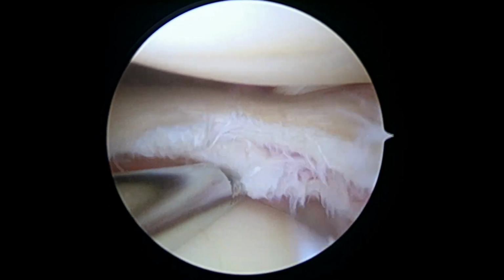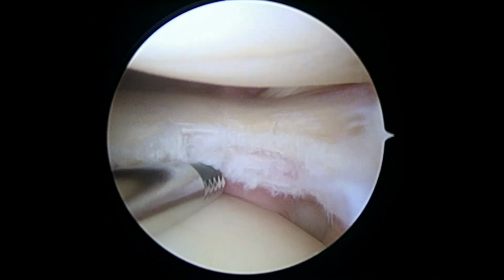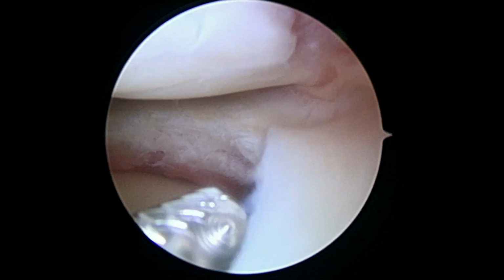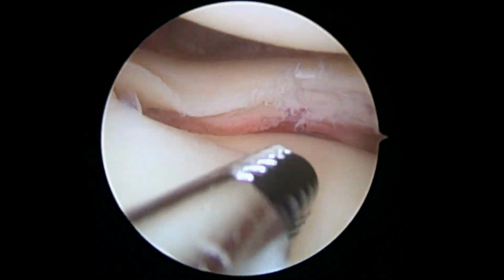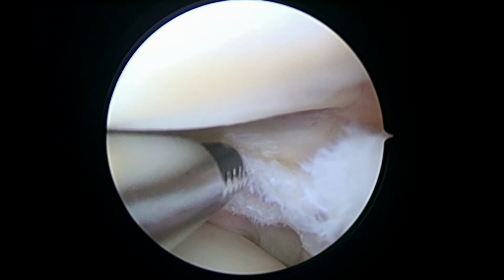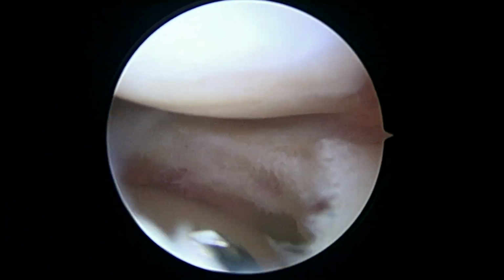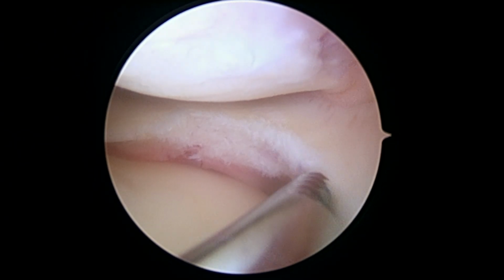So some of this is already kind of taking care of itself, as you see here. In fact, I don't know that we can do anything else to the meniscus at this point. Posterior horn back here looks pretty good, so that's the main part we were worried about. This is already torn and there's really nothing left to repair there. And then here anteriorly, same story. And so now we have a pretty good look. So I don't think we have to do a meniscus repair.